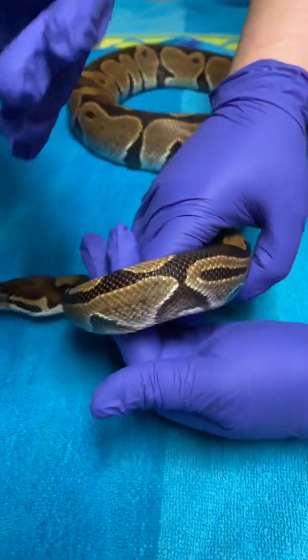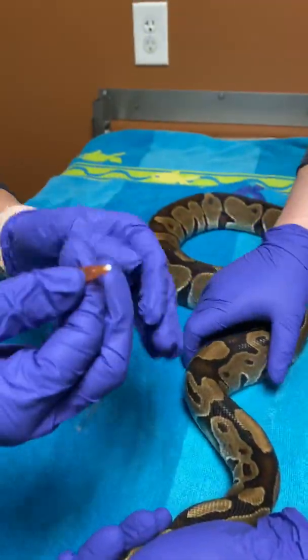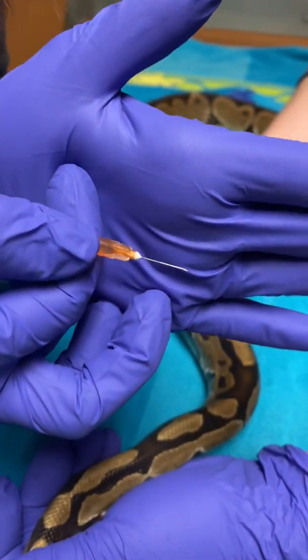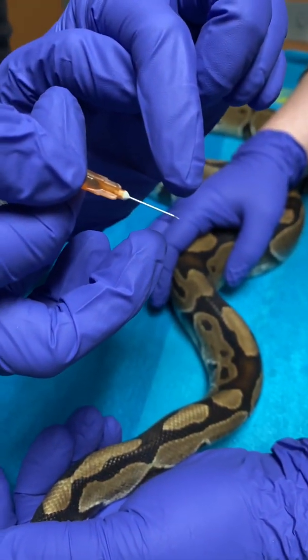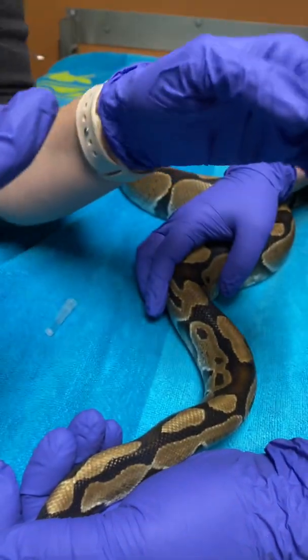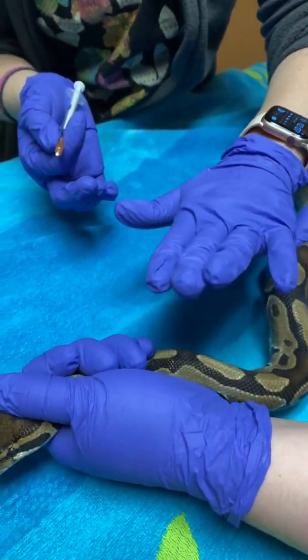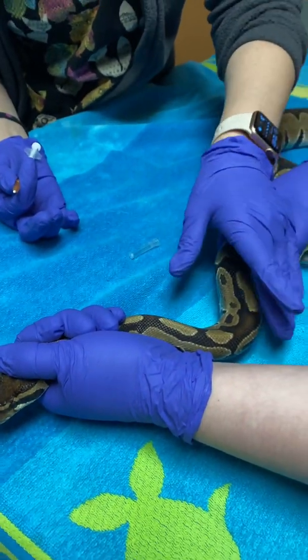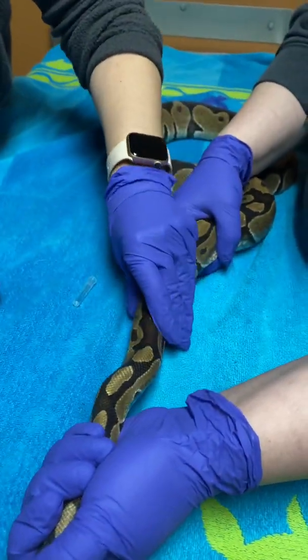We have our injection — it's completely thawed. On a needle, they have what's called a bevel; you want the bevel side up, so the slanty part going straight down is how you want to go in. You'll need somebody to help hold because they are wiggly. Have somebody holding the top half and then the lower part, so it stabilizes the middle section where you need to work.